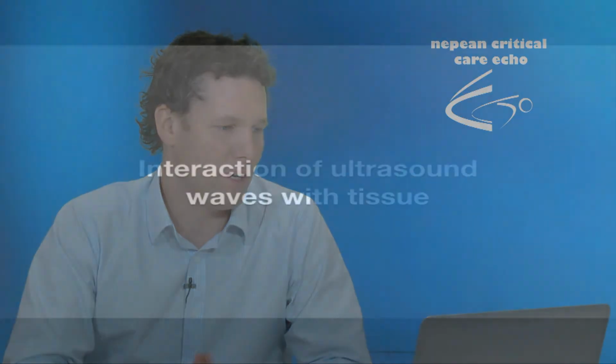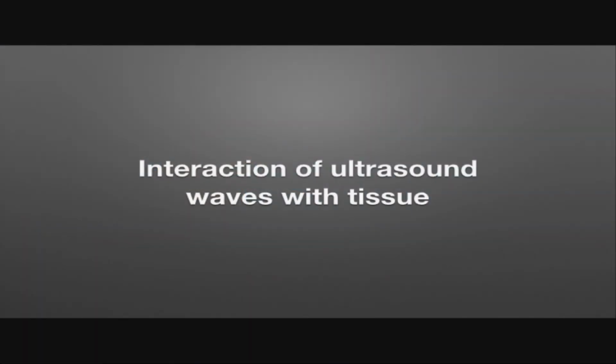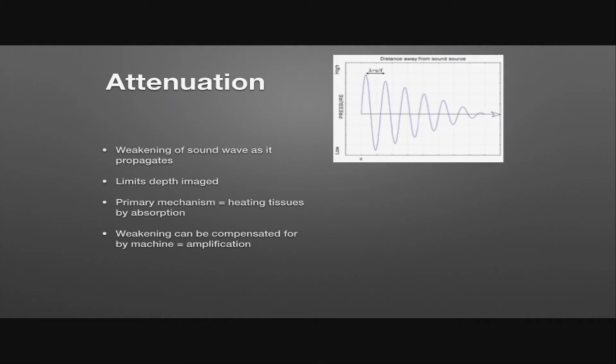So next, let's consider the interaction of the ultrasound waves with tissue. And in particular, we're going to be talking about attenuation. Attenuation is the weakening of the sound wave, or the loss of its power as it travels or propagates through the tissue. And this means that we're going to limit the depth that we're going to be able to image.